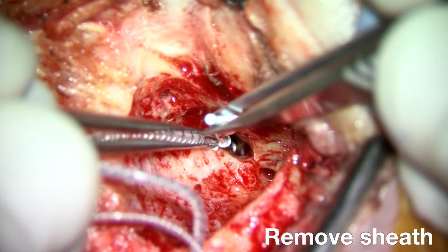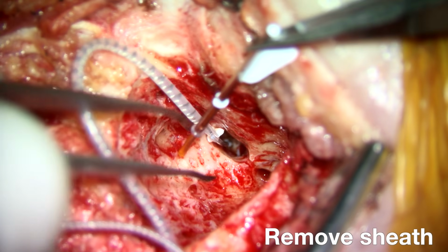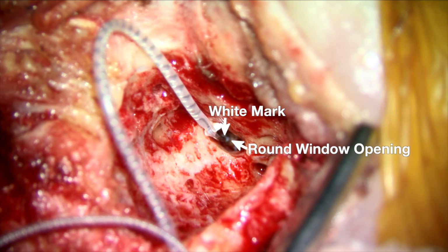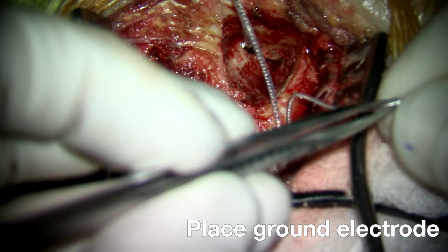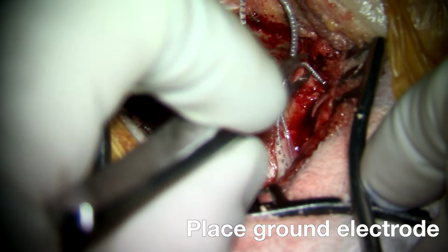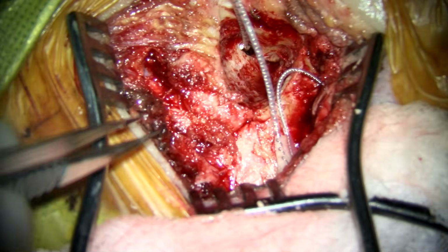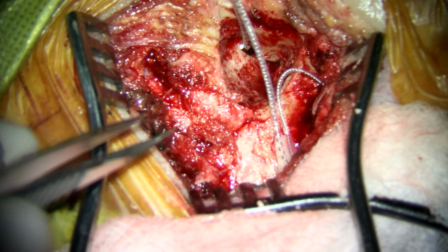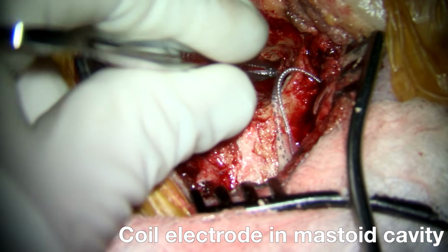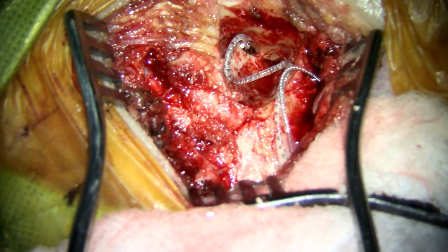At that point, the sheath can be removed, and you can see deep down the recess that the white markings on the electrode are just adjacent to the round window, signifying a complete insertion. The Cochlear brand implants have an additional ground electrode that you have to place separately, so here we are placing it under the temporalis muscle anterior to the implant. Regardless of which electrode you do place, you want to coil the excess into the mastoid cavity. I find that the easiest way to do this is to aim for the aditus, but you don't want the electrode touching the incus or it can dampen sound in cases of hearing preservation.